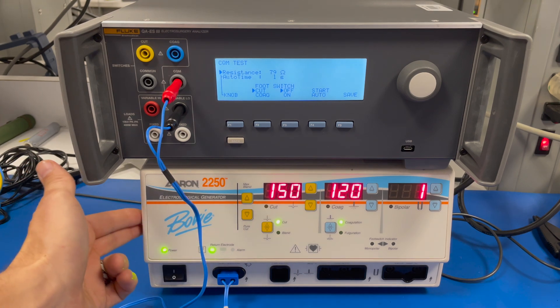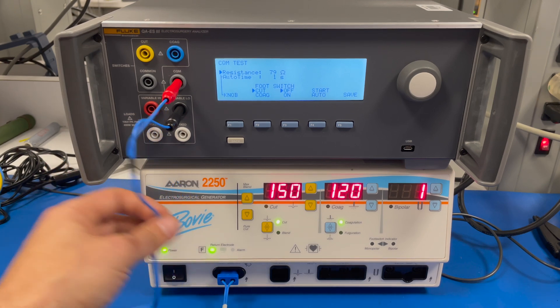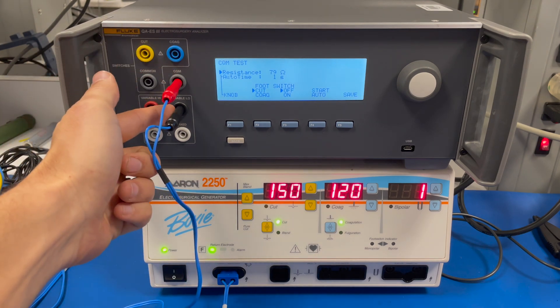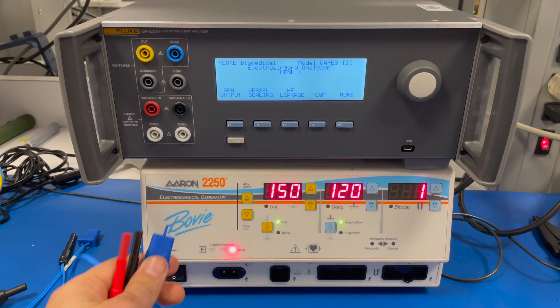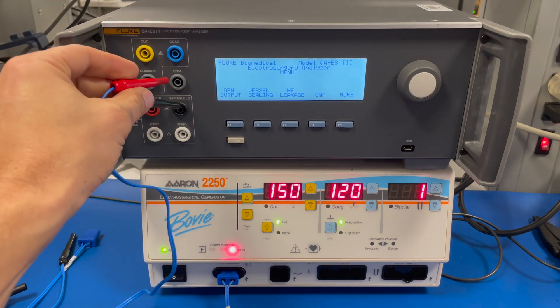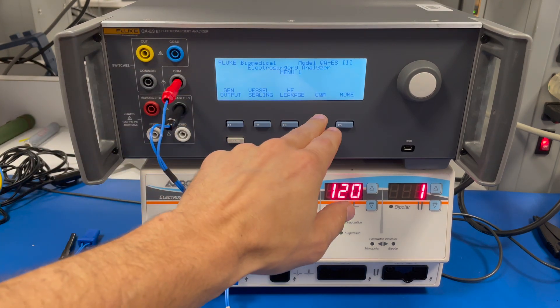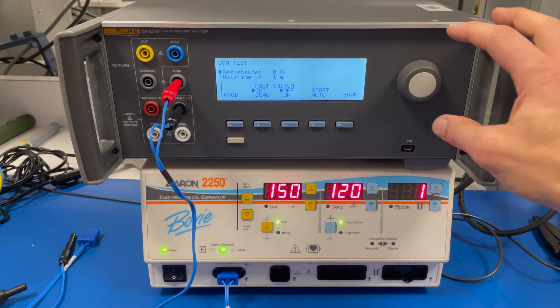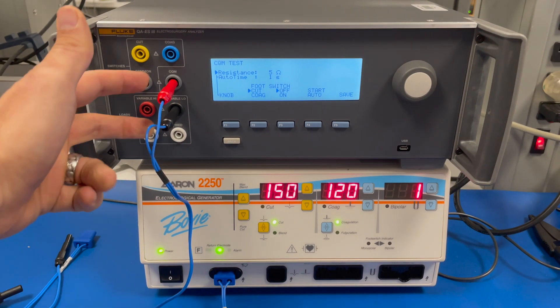Let's look at how you use your analyzer to check the return electrode monitoring circuit. You need to know the values for your specific generator. We've connected the return to the CQM port and the variable load jack on our Fluke tester. CQM refers to contact quality monitor — that's Fluke's version of REM, or return electrode monitoring. You plug this into your return electrode, connect to the CQM port, and go over to CQM. As you increase the knob, you're changing the resistance between these two ports.